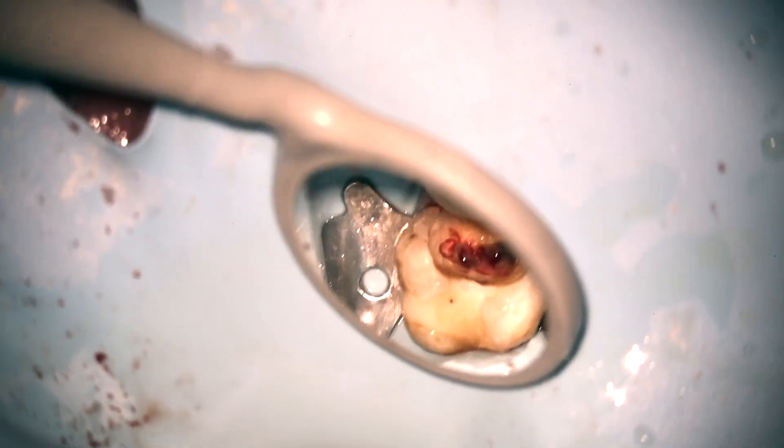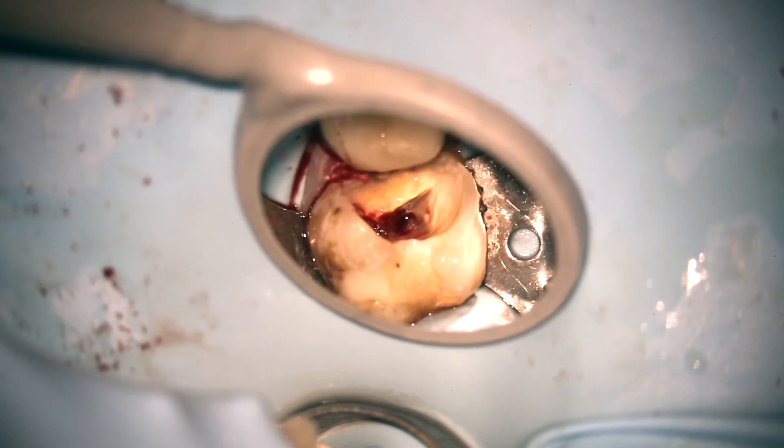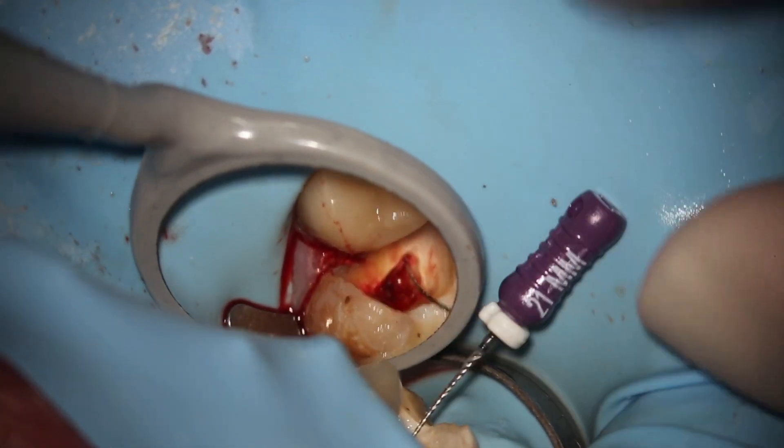You're kicking butt right now. Look at that — we've got a nice clean access, decay is removed, and we are ready to get to the RCT playbook. This is why you bought this book: the RCT playbook. Coronal negotiation first with a 10c shorty dipped in RC prep. Look how fast it is — canals are wide open so they're easy. It pops right in. Some of them are tight — little up-downs until it's loose.